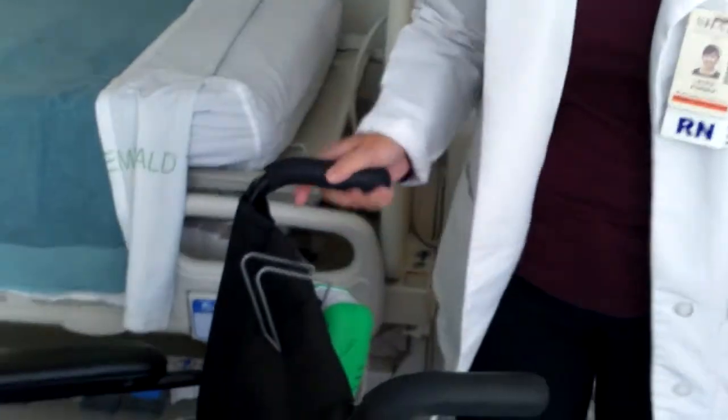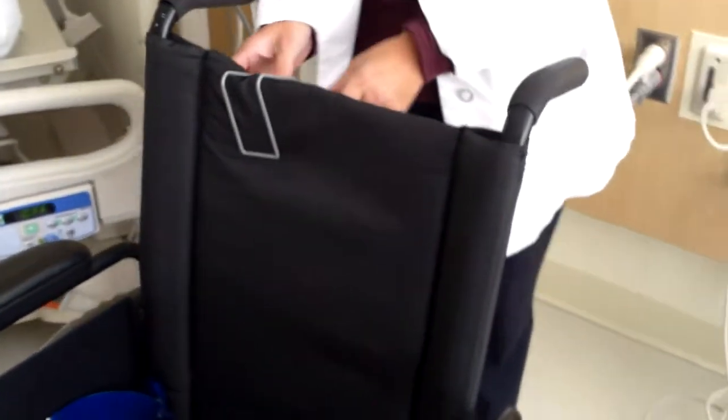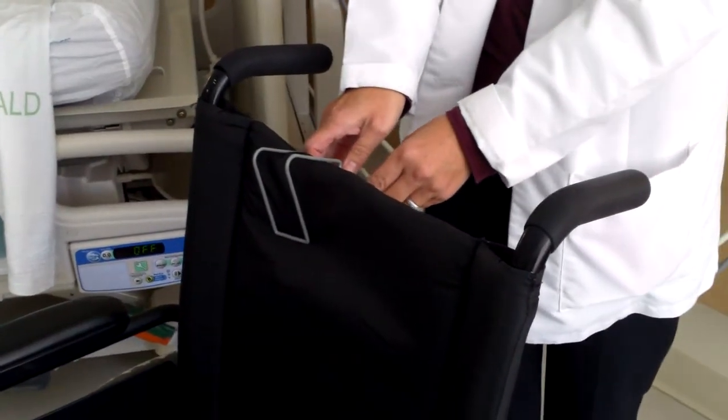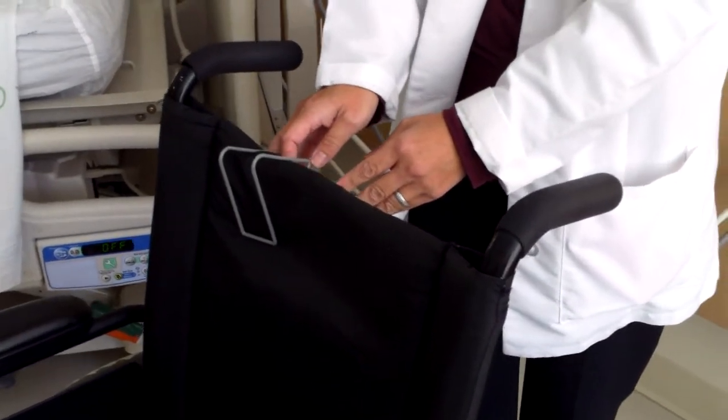So then we're good. It's turned on, and if the patient disconnects, the alarm still goes on, and now the call light goes on. So we're good, thank you.